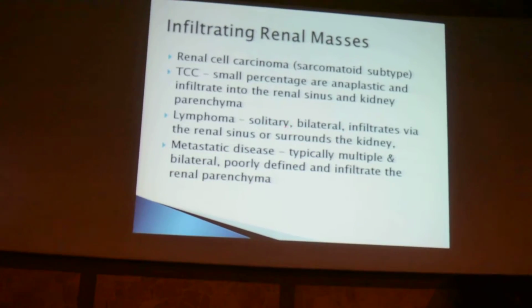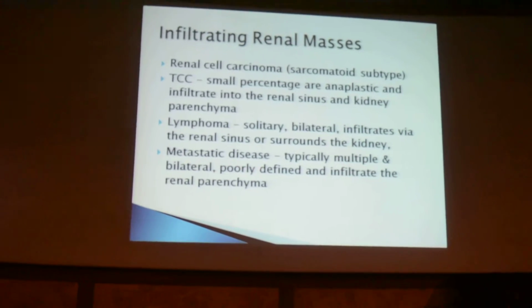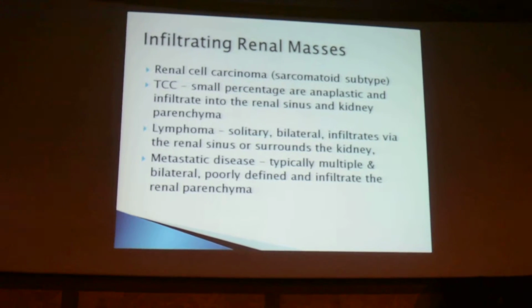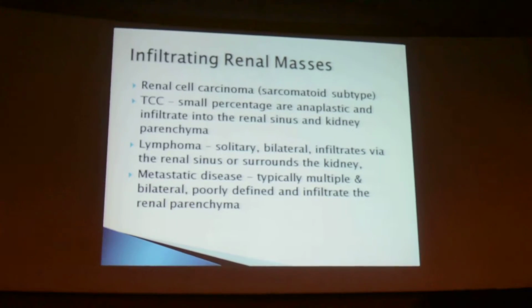They can be infiltrative or solitary, and usually they are bilateral. Metastatic disease is also from a primary, usually from lung, breast, and colon. So they are also usually bilateral, and they are poorly enhancing.